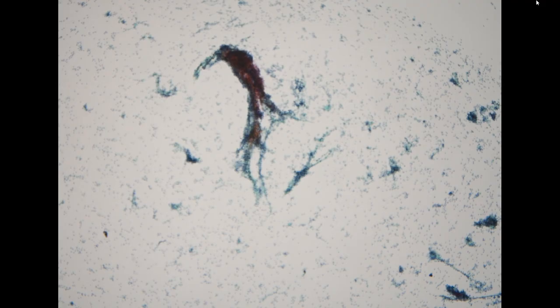The patient actually had a prior history of low-grade papillary urothelial carcinoma as well as papillary urothelial neoplasm of low malignant potential. So this is a typical presentation of a urothelial specimen that is suggestive of low-grade urothelial neoplasm.